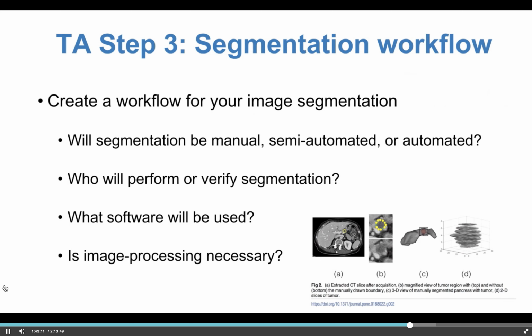Is it going to be a non-radiologist that you train specifically to extract, say, the liver contour? We have people who work in a volumetric lab who perform liver segmentation for clinical practice to estimate tumor and liver volumes after surgery. They undergo a significant amount of training, so we can use them for research as well. What software are you going to use?